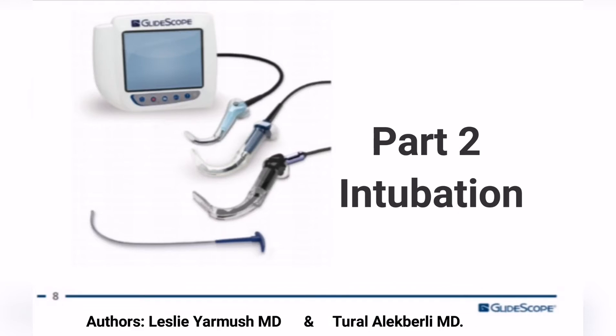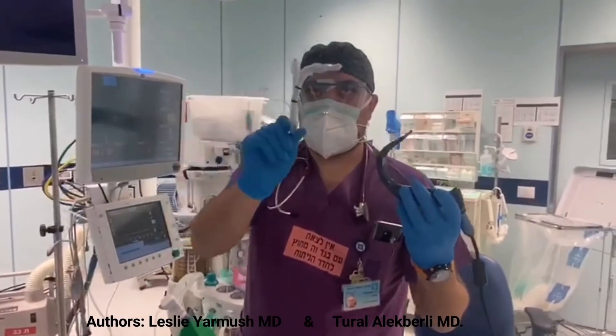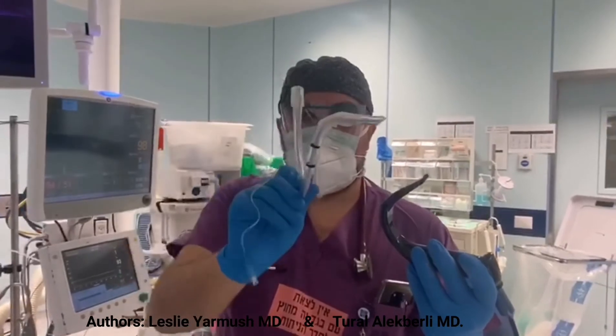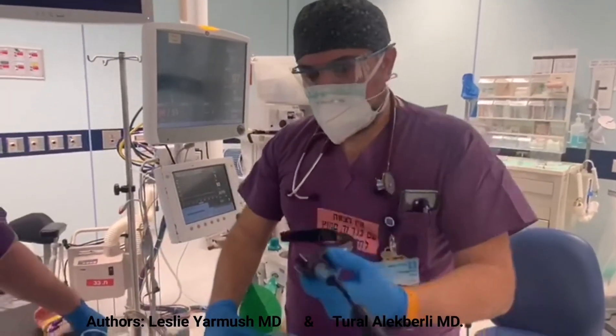Second part: intubation. The patient was consented for the video. This is an expected difficult intubation case due to the short neck, short thyromental distance, and high Mallampati score. This is our special shaped intubation tube, and I'm holding the GlideScope blade.